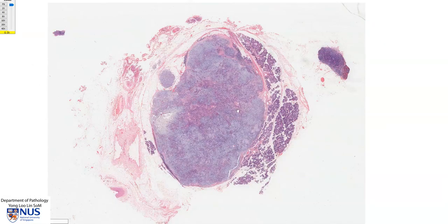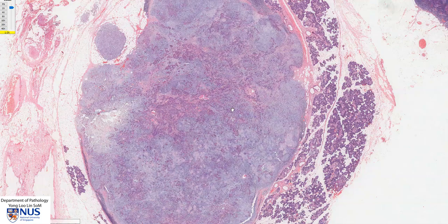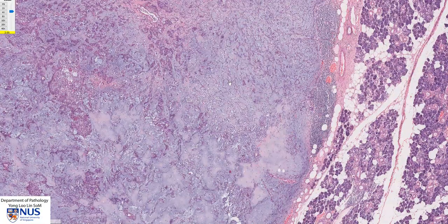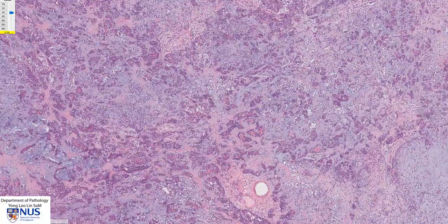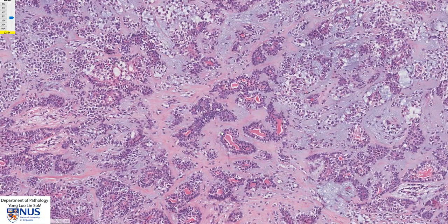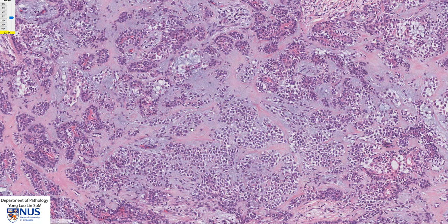In summary, we have here a virtual microscopic slide of a pleomorphic adenoma. This is a well-circumscribed, partially encapsulated tumour. We can see a chondromyxoid stroma with chondroid areas and blue-grey myxoid areas. There are two cellular components that form tubules and nests: the inner lining cells are the epithelial cells, and the outer lining cells are the myoepithelial cells. Most of the cells seen in the chondroid stroma are the myoepithelial cells. There is no evidence of malignant transformation in this case. Thank you.